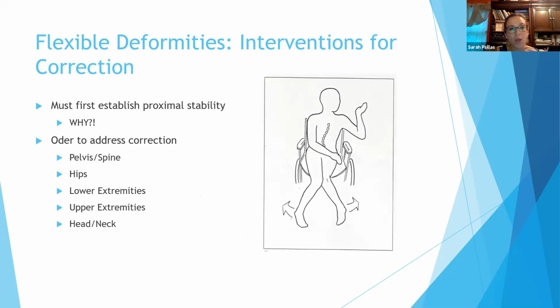Usually this conversation I have is very interactive, so I'm going to do my best to do it without the interaction. So you want to start proximally and move distally. So it's really important that you focus on the midline and move outward.